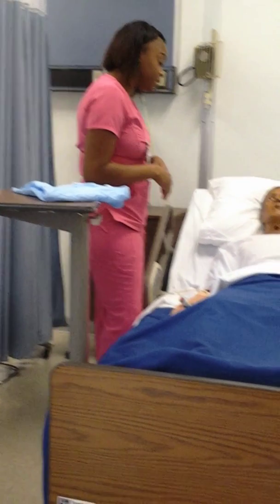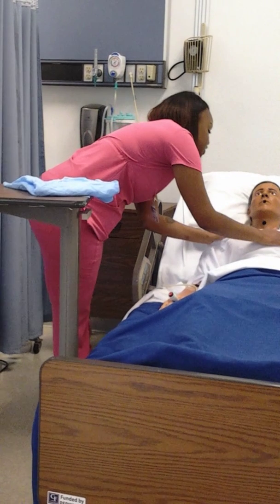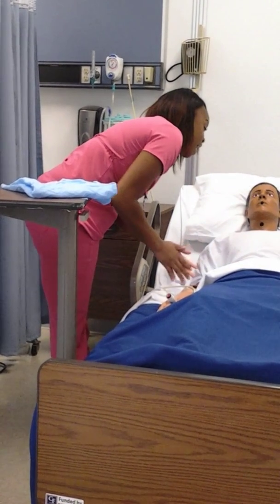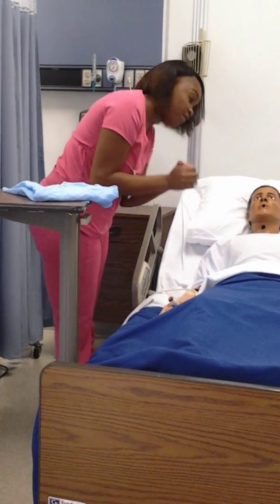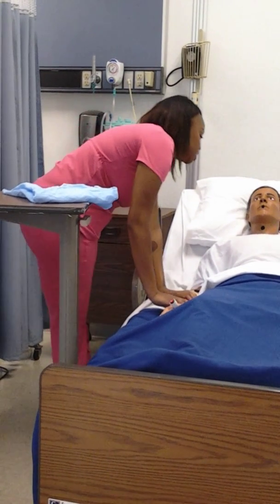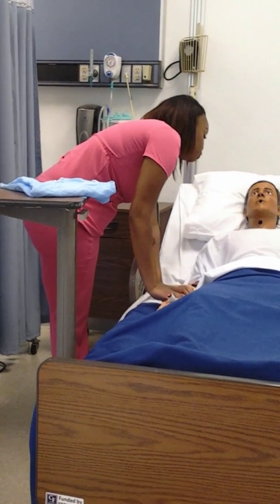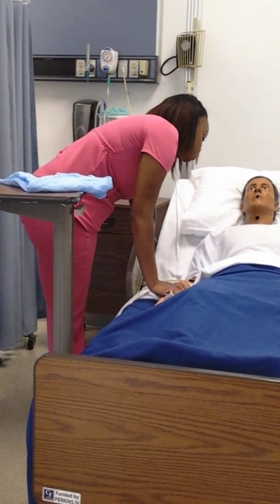I'll explain the procedure to the patient. Mrs. Jones, because you have a few secretions and I heard a few crackles in your lungs, I got a doctor's order and I'm gonna go ahead and suction you, okay? Have you ever had this before? No. Okay. It's just gonna be a little tube that's gonna go in through your nostrils and it's gonna go into the back of your throat to help get some of those secretions out, okay?